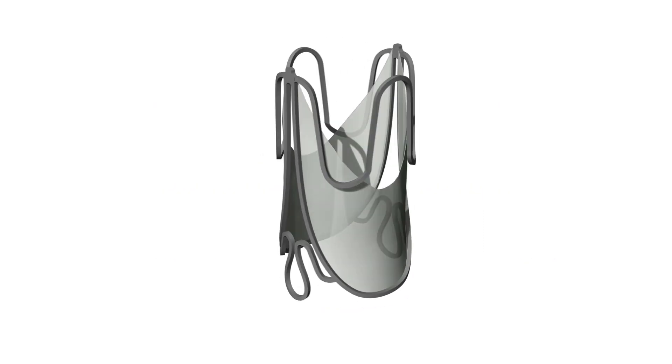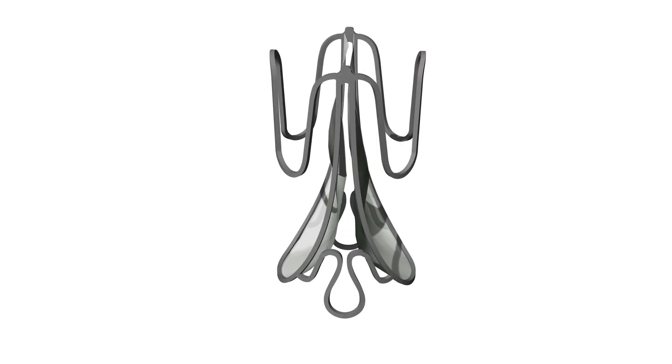The Otis Size Adjustable Valve, or Otis Valve, is a novel synthetic expandable surgical pulmonary valve replacement that is specifically designed to meet the growth needs of children.